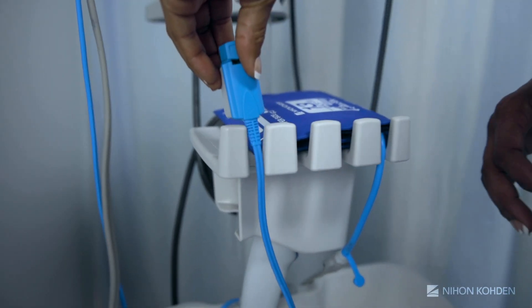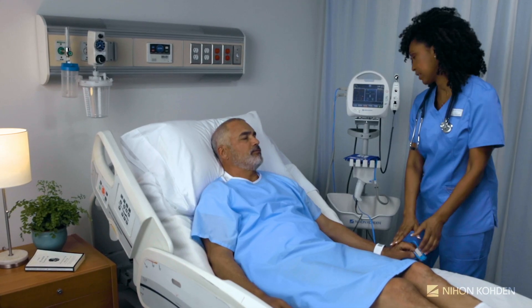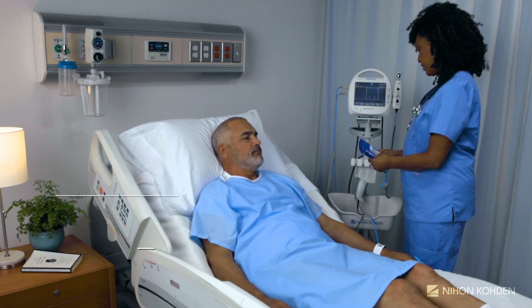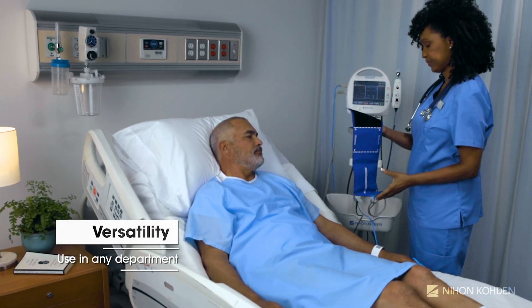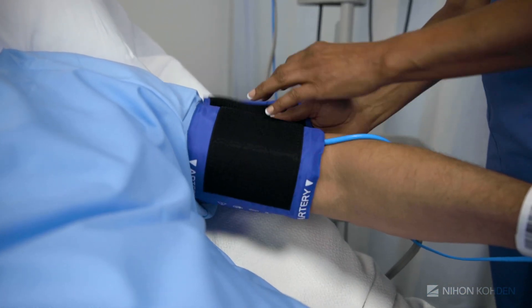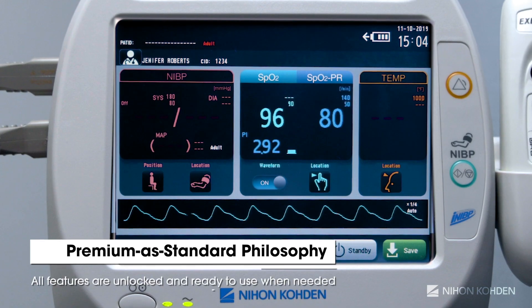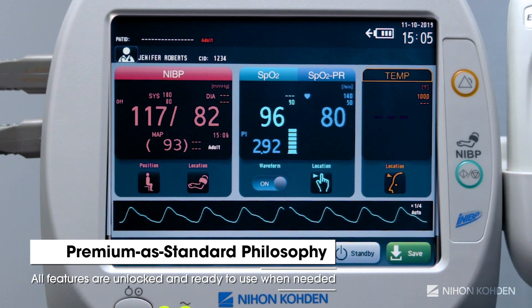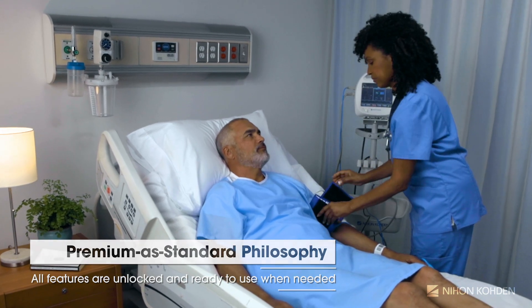Thanks to NeonCoden's premium-as-standard philosophy, the LifeScope SVM7200 can be deployed across a range of departments, from outpatient to emergency departments to med-surg. This philosophy, which is at the heart of all NeonCoden technology, is that every piece of equipment should be fully appointed with all features, both standard and premium, unlocked and ready to use at a moment's notice.